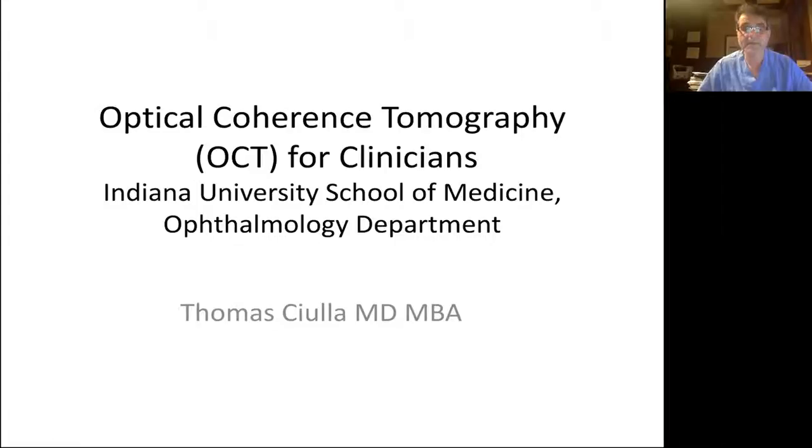And then a question about whether hyperreflective material can be seen overlying choroidal melanoma. That I would not be 100% sure about. I have to research that more. I didn't really get into neoplasms in this lecture. However, choroidal melanoma can be associated with choroidal neovascularization. So I'm not sure if the SHRM would denote choroidal neovascularization in that situation or not.